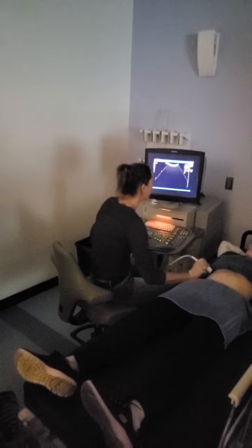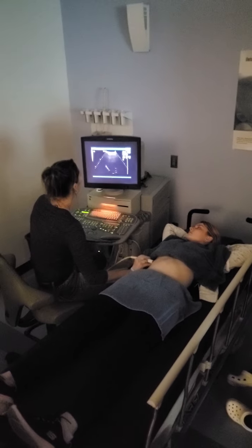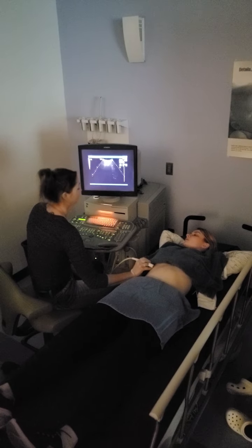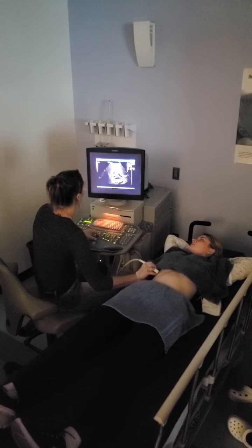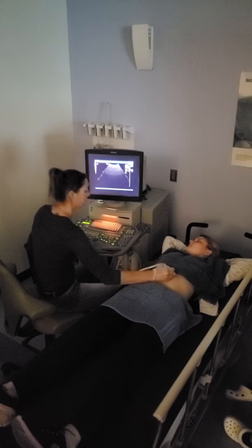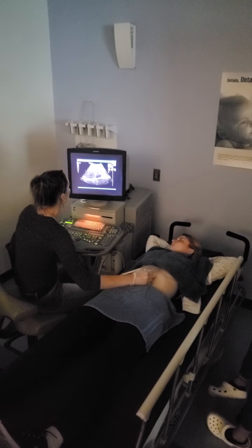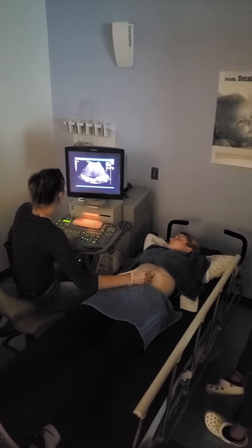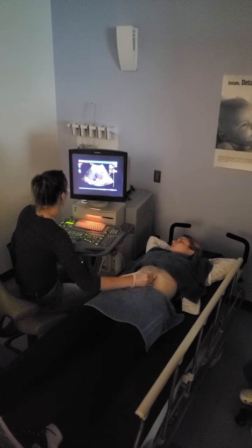So here's my window for portal vein. And then I can angle up or maybe move up a rib space. Go ahead and breathe out, which is a really hard breath out. Hold it. Just never fun to do. So we found our window for our hepatics. We found our window for our portal, but sometimes the hepatics can be difficult to see here. So go ahead and breathe. We have that backup window, and when you're ready, big breath, hold it. We have that backup window of the bunny sign. We can use the bunny sign if we need to, so we can sample the hepatics in here.